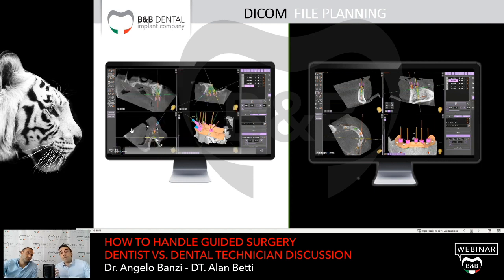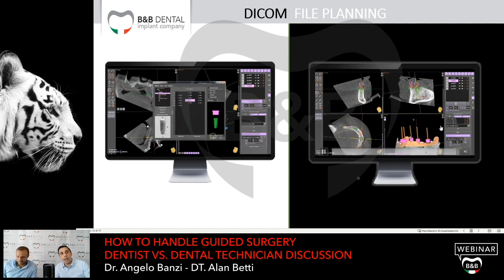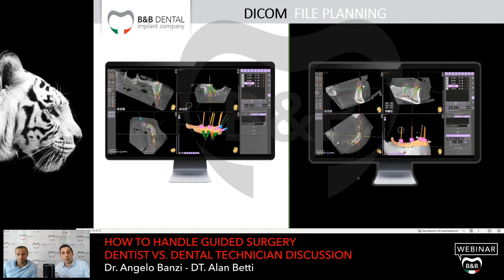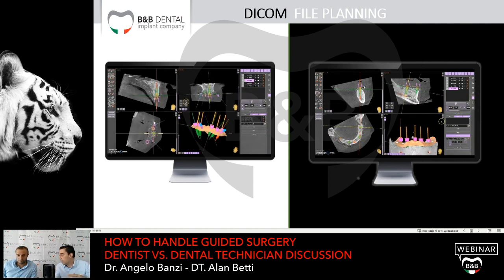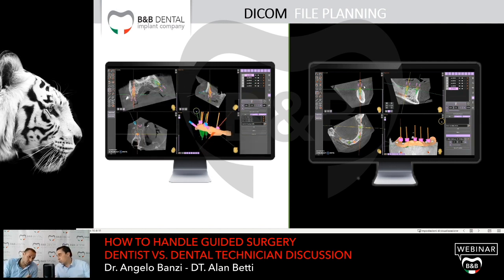In this case, we have figured out this problem. As we can see in this image, the sleeve goes into collision with the soft tissues. Much of its length is in collision with the anatomical part, and this is a big problem because if the sleeves collide with the anatomical part, they could destabilize the surgical template. It will be a big problem, not only because you have to open a flap, but it can also prevent the right positioning of the surgical template.